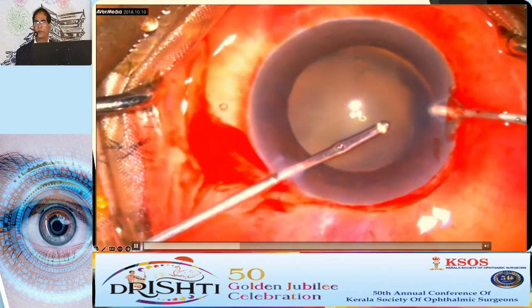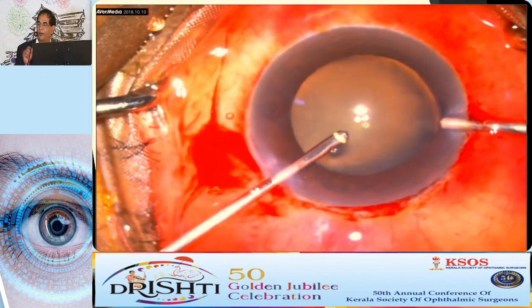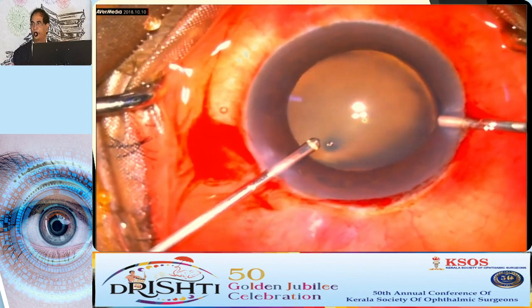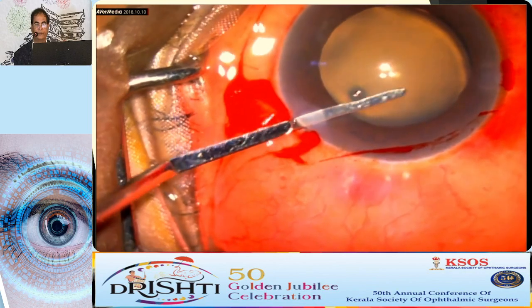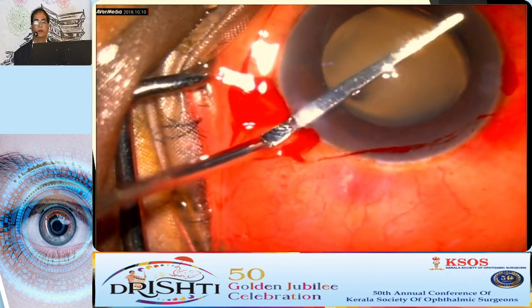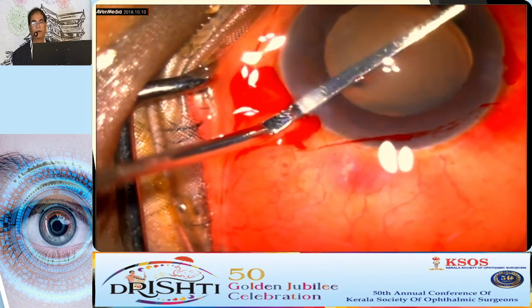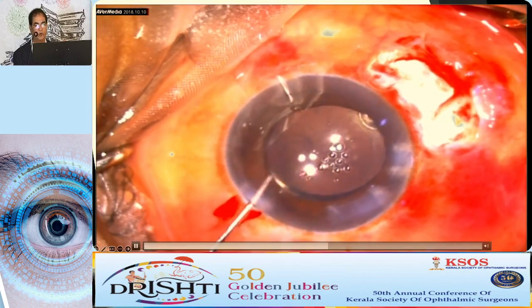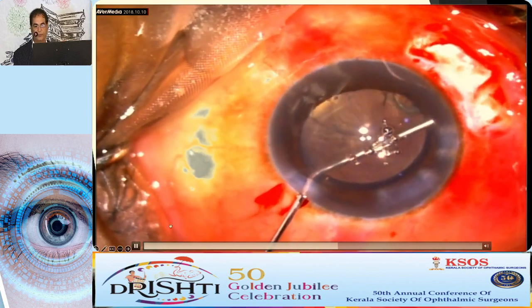However good a vitrectomy you do, there will be some vitreous strand in the section or in the side ports. So you have to be careful and remove that strand. See, this is what I am doing, and you can see that some strand will be there. You can bring it to the center. Now we can go about your cataract surgery and finish off the subluxated cataract.